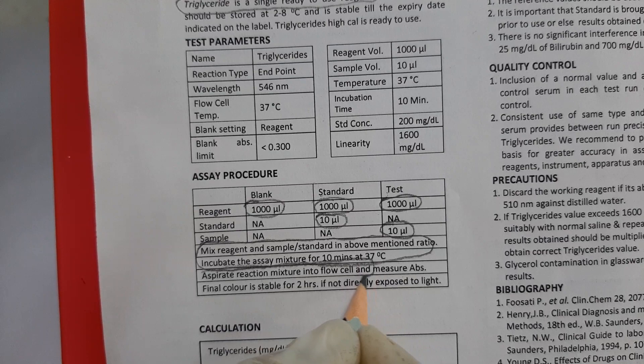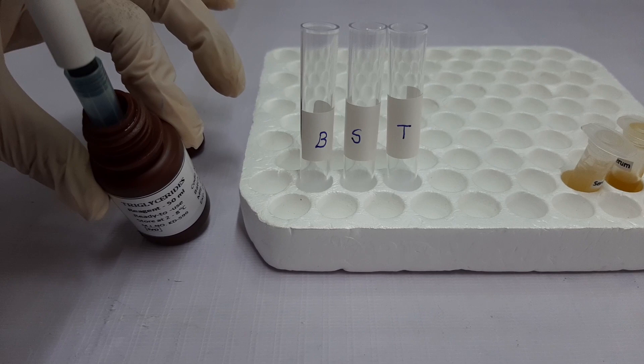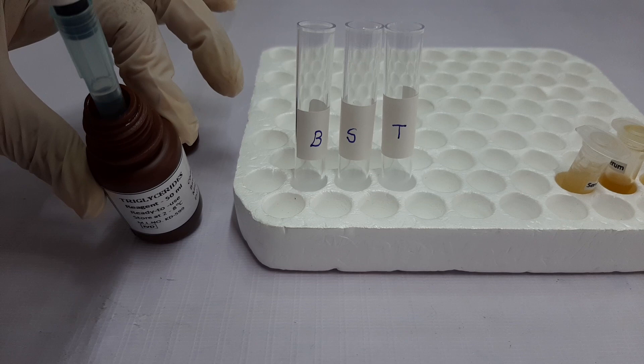Then we will mix the entire reagent mixture and incubate it for 10 minutes at 37 degrees Celsius, and then aspirate the reaction mixture into the instrument to take the absorbance. Let's see how we can do it. So first we will take 1000 µL of triglyceride reagent without air bubbles and pour it into all 3 tubes.